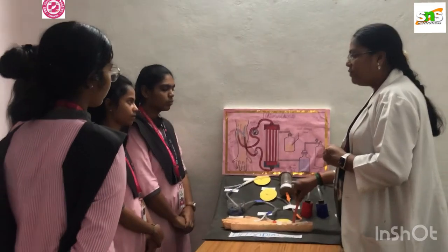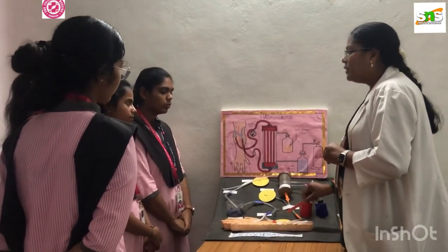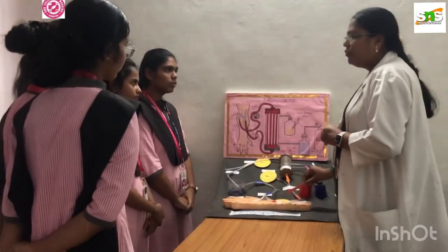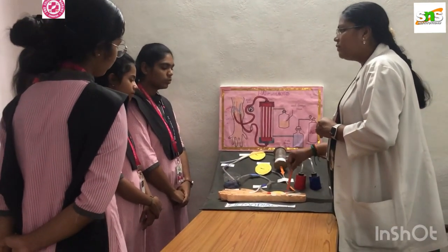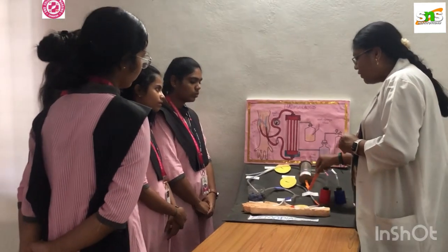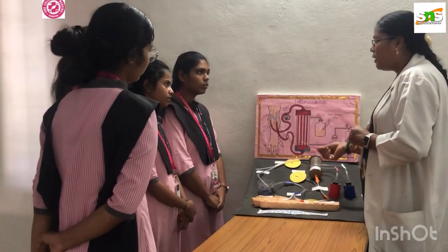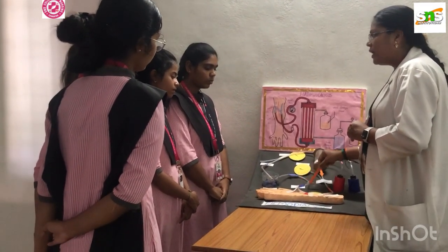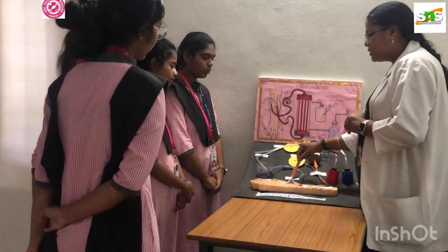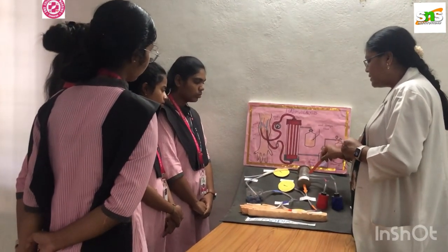If it is the AV fistula, it goes to the AV fistula side, or else it will be punctured into the venous vessel. You understand? Only the venous vessel will take the purified blood to the heart, and then it is pumped towards the entire body. So we take blood from the artery and pump it into the dialyzer machine.